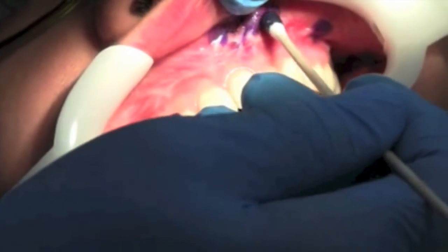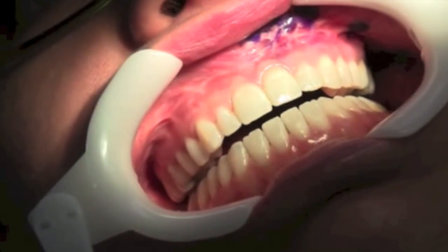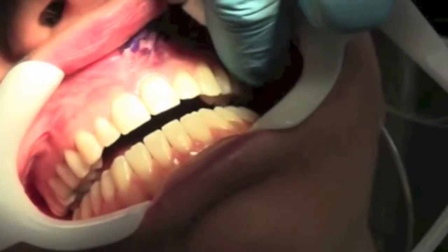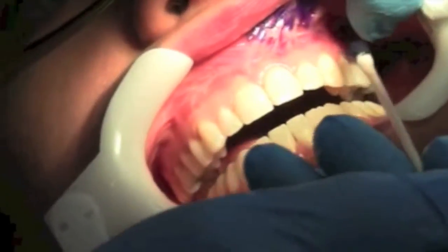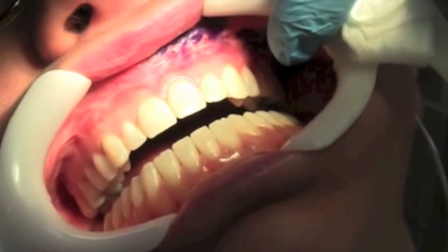You would retract, dry, and apply above each of the tooth. Now, if you were working above the 4 and the 5, you would place topical above the 4 and the 5, and those would be infiltrations associated with the MSA.